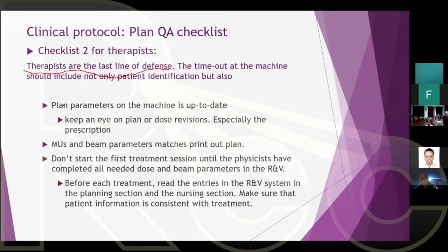A timeout, by the way, is not only for new patients and new plans. You should have a timeout every day for every fraction, even if this was the last fraction for this patient, 25 out of 25 fractions.